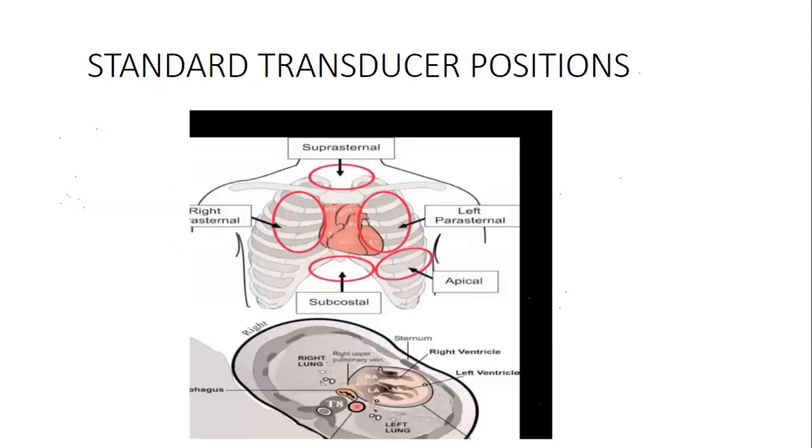So the standard transducer positioning. Typically we've got 4 to 5 positions where you can put your transducer.